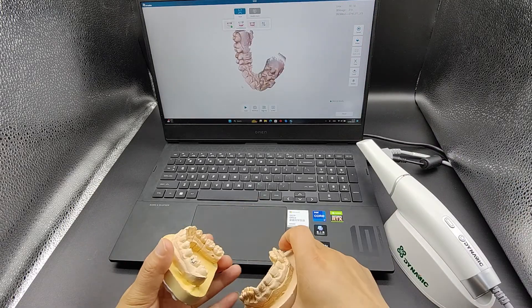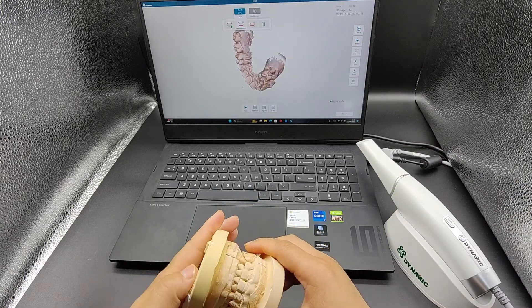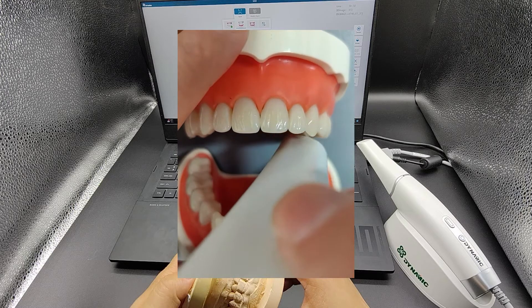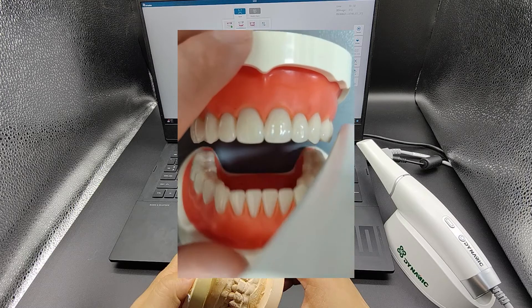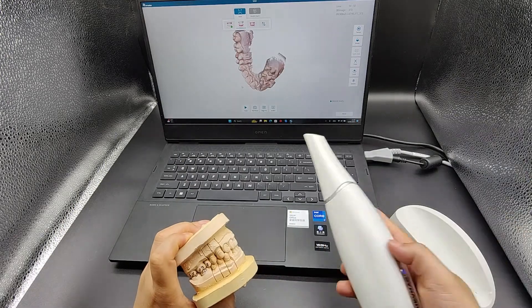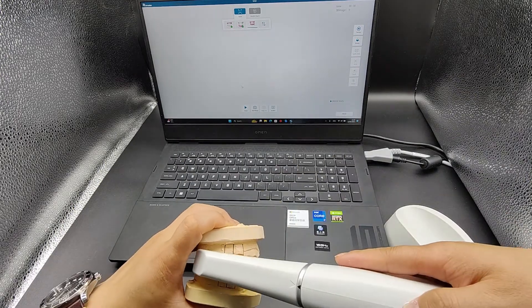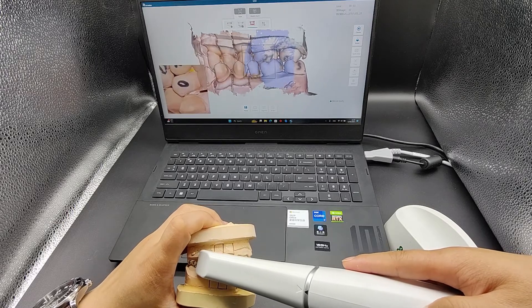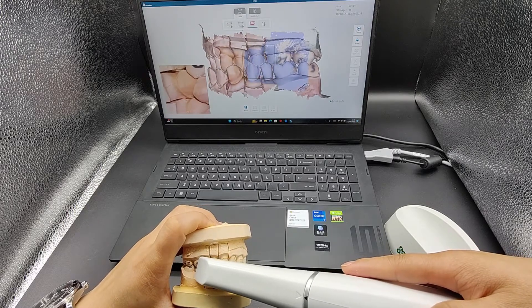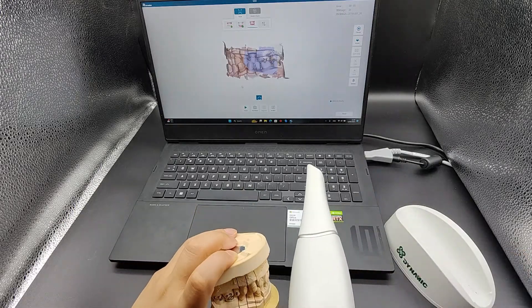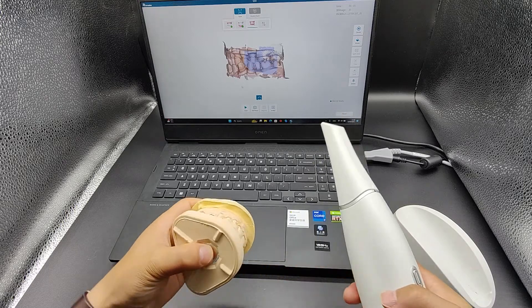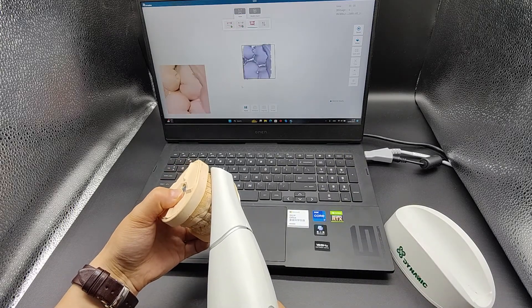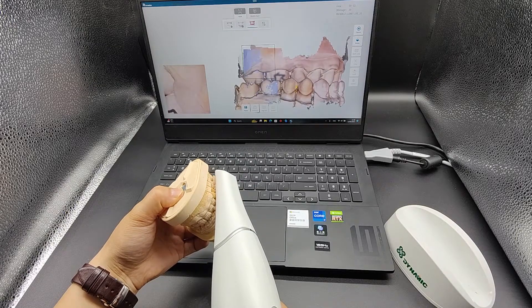The third part is a bite scan. Scanning can be done with slight upward and downward movements. It is also necessary to ensure that the patient's bite relationship is correct during scanning and maintain the bite relationship unchanged.